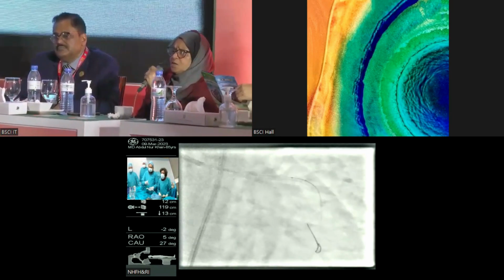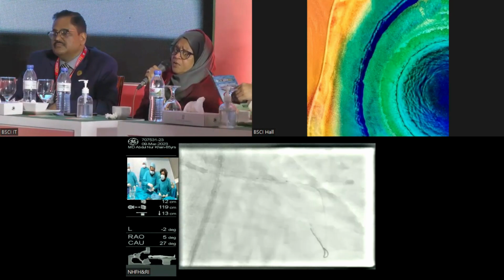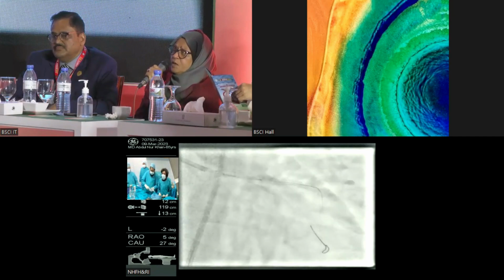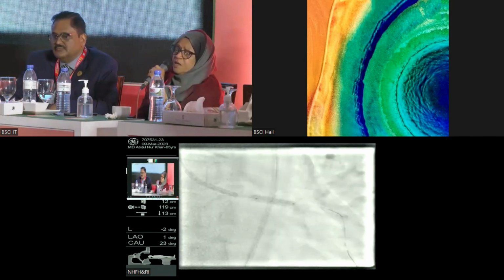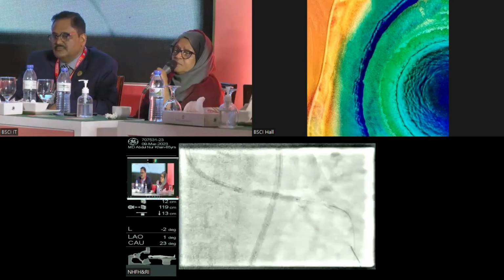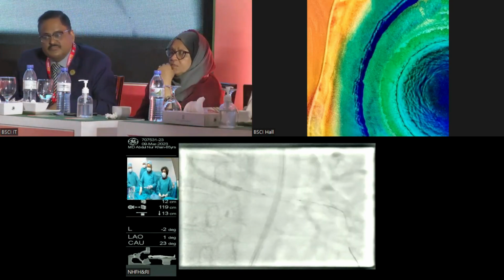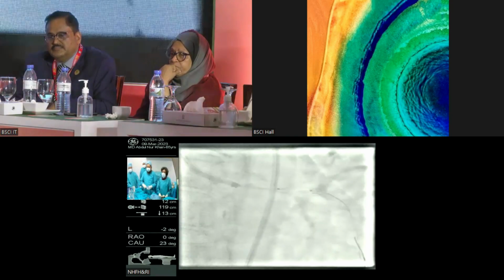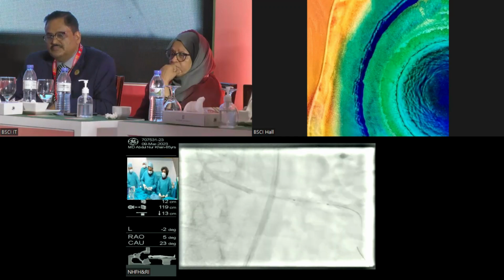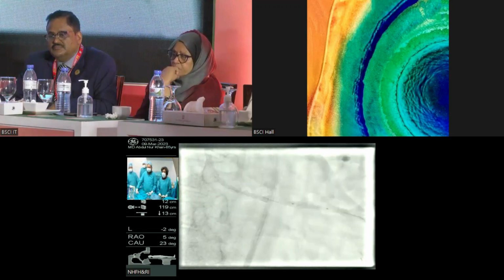One other thing, I know a lot of you are now doing main stem and bifurcation lesions. Has any of you done IVL for these lesions? Can you throw some light on it, please? Yes, madam, we've done IVL on left main, and after that we did a double stent technique, a culotte technique, because the disease was so severe. Here we didn't do IVL because there was nodular calcium as well, and in nodular calcium, the rotor actually works better.